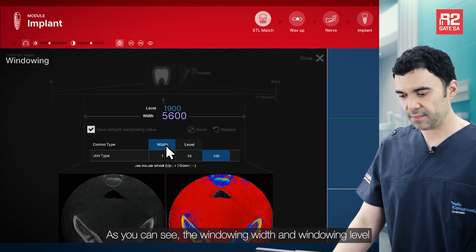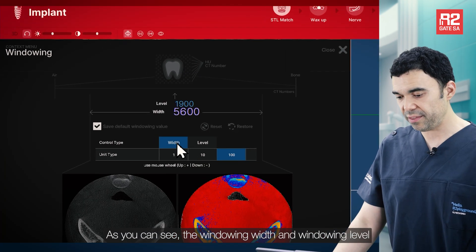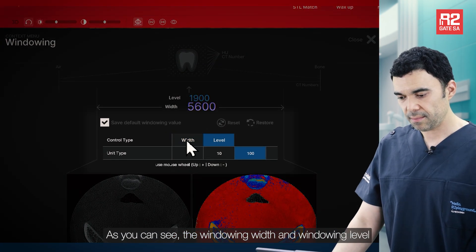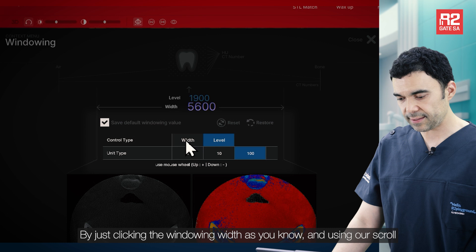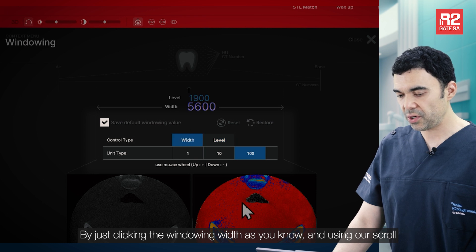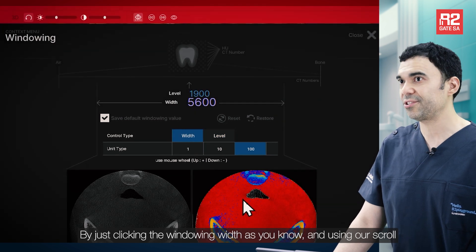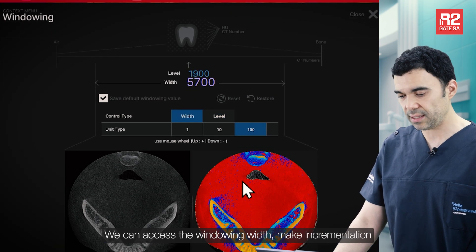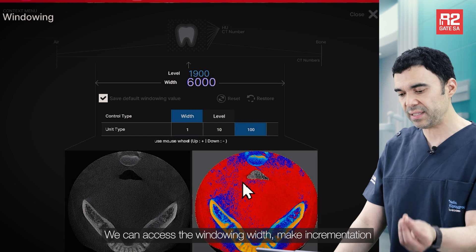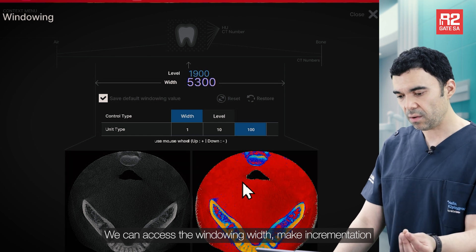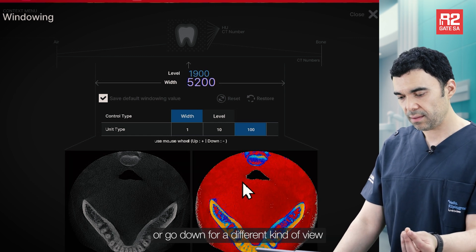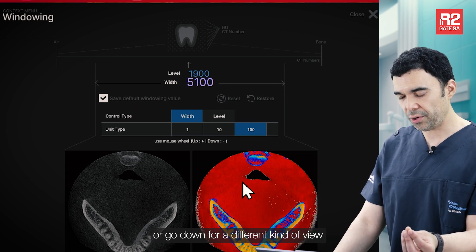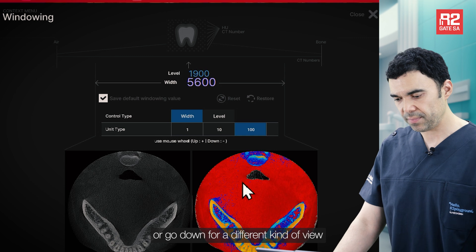As you can see, we can adjust window width and level by just clicking the window width and using our scroll. We can access the window width, make incrementations, or go down for a different kind of view.